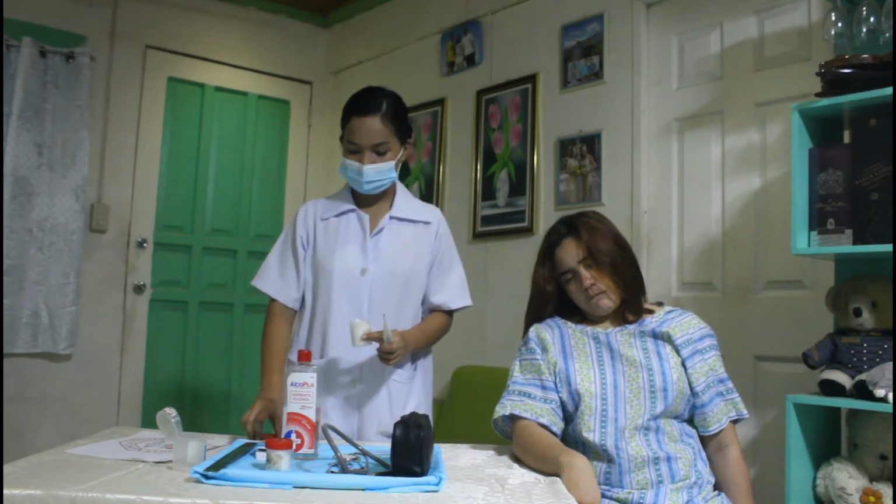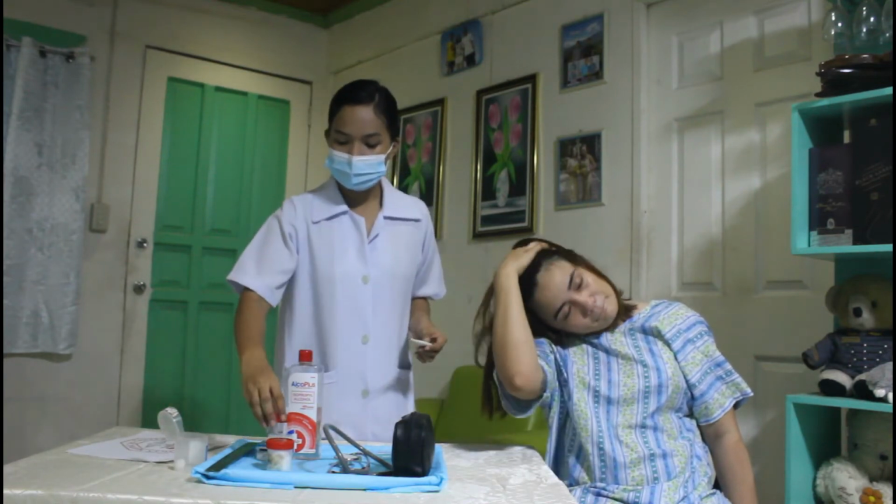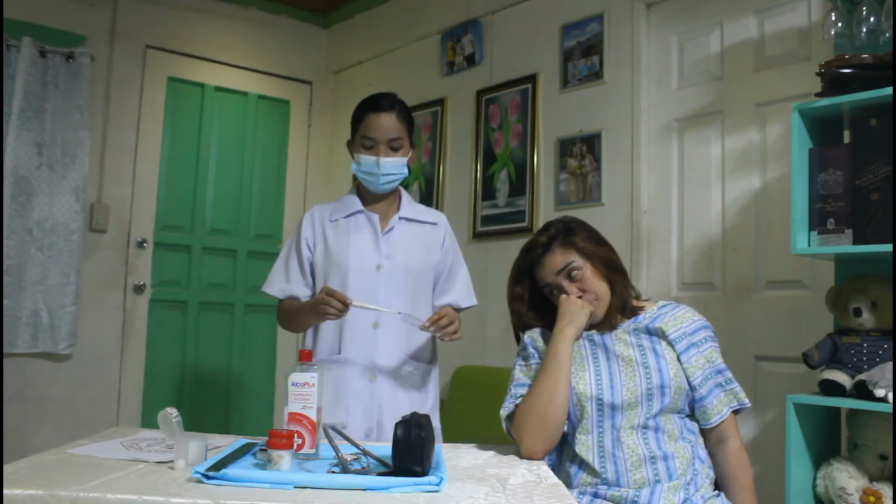Now, we wipe the probe or the sensor of this digital thermometer with an alcohol swab. This will reduce transmission of microorganisms. Then put it in a trash receptacle. And then return the digital thermometer to its storage. This will give protection to the digital thermometer.